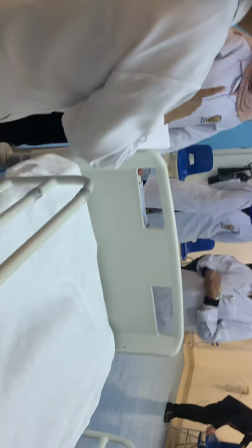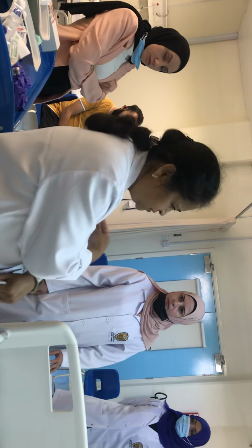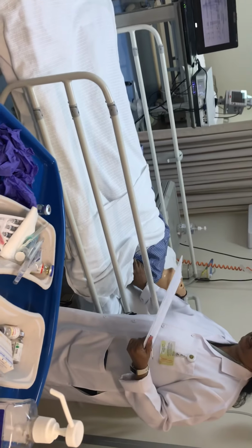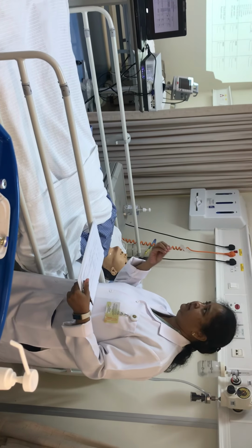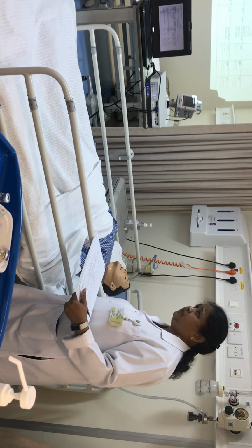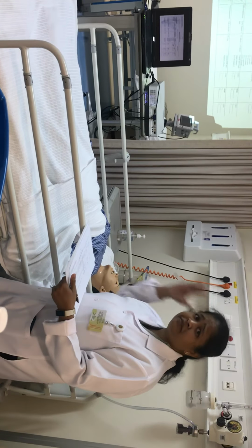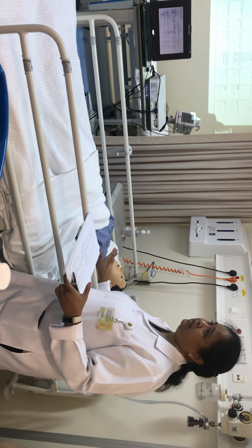Assessing, as I said, whether there are any lumps or if it is very hard. If it is going to be a hard area, somebody has given again and again, the medicine will not be absorbed at all. So we need to touch the patient's hands and then assess whether everything is fine. Or any lesions or any discoloration. Then tell the patient that the blood sugar is this much, the doctor's order for you is 10 units, because most of the diabetic patients know, they are taking it at home. So you need to give the instruction.